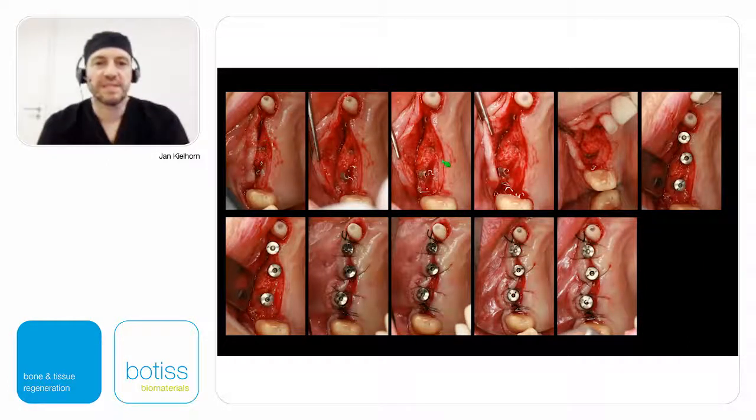So then you see it heals nicely. Implants are also overlaid by bone, so the bone even covered partially the implants, which we had to take partially away, which is very interesting. So this seems to be very vital. Then we placed, of course, gingiva formers and again did an apical reposition flap to even improve the keratinized tissue around our implants.